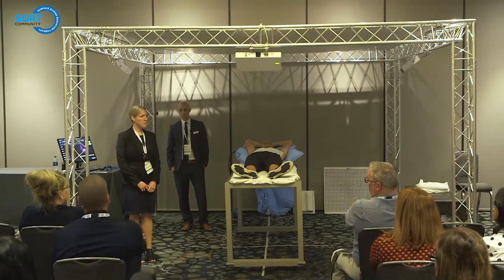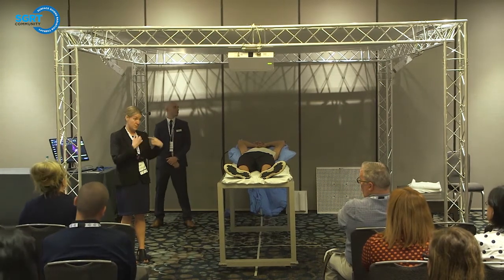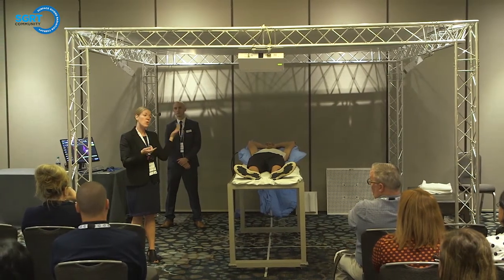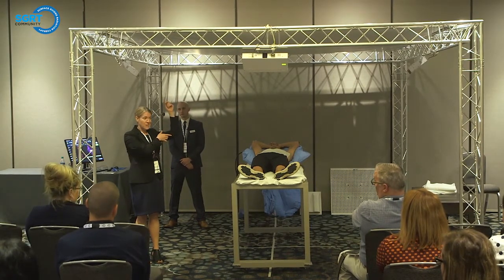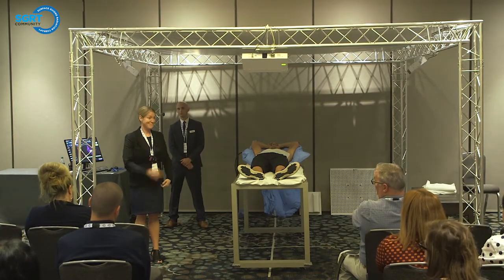Okay, so the centroid would be for your ROIs. You can either have an ROI isocenter, which is the ROI drawn around isocenter where you're treating, and you can do the treatment captures to set your arm and extremities up for positioning, or you can do the centroids. Those are additional ROIs that you can draw. You could draw an ROI centroid of the arm and get that into the right position on the patient. You could do a chin.